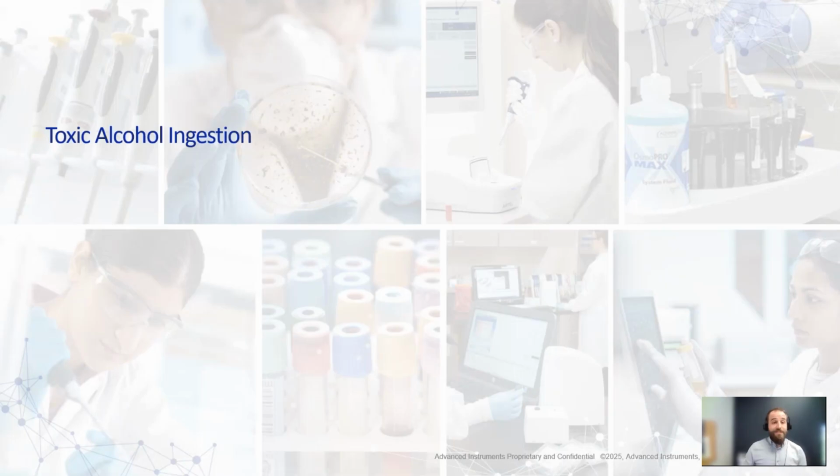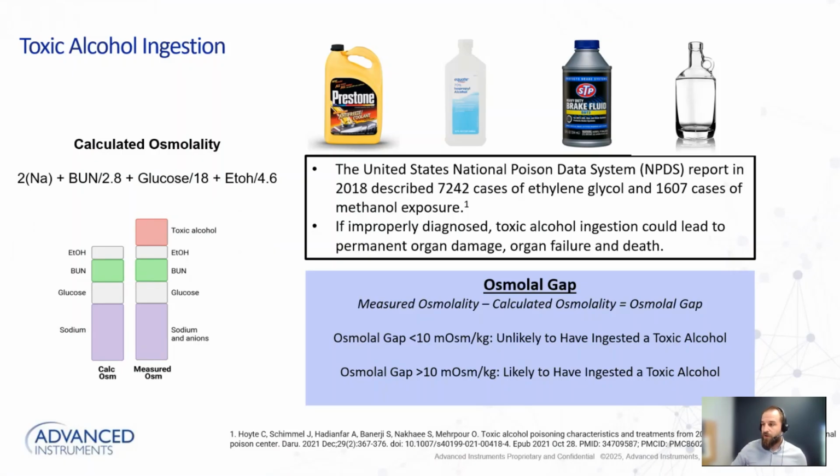Okay, the next example that we're going to cover today is toxic alcohol ingestion. So again, this isn't the alcohol that we drink when we go down to Harpoon in Boston to have a couple beers. These are things like antifreeze or isopropyl alcohol, brake fluid, or methanol, which is represented by the clear bottle over there. So typically, when we suspect that a patient has ingested one of these things, what the physician will order is the Osmolal Gap to determine whether or not a patient has ingested a toxic alcohol.